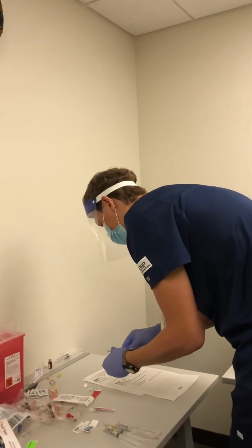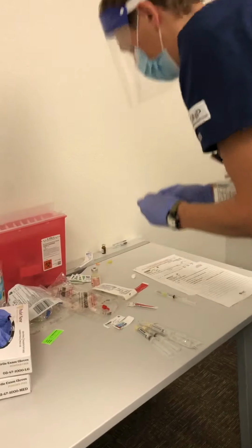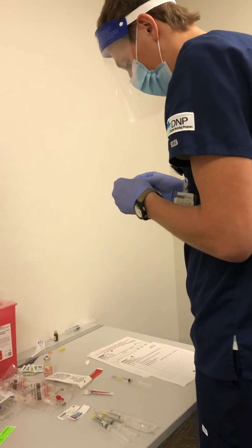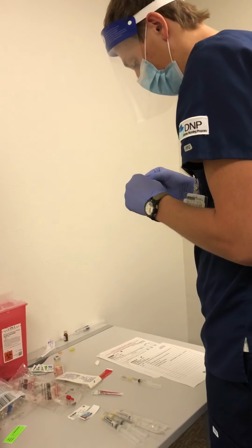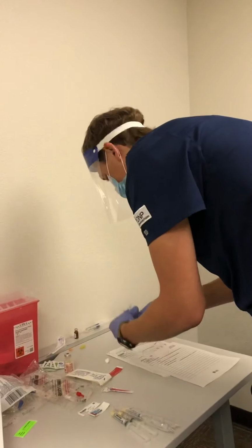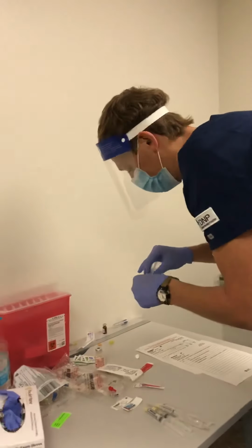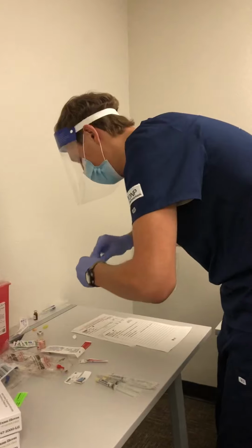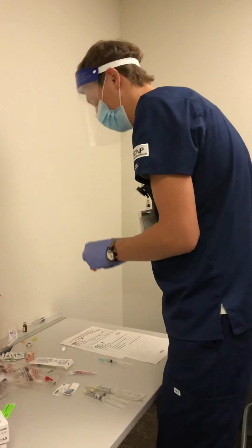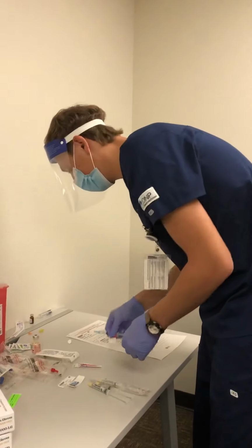And I can then dispose of this needle and get this cap ready. So the needle will go into the sharps bin, and then this will just be a protective cap so that it stays sterile while I take it to the patient's room from the med room. Go ahead and attach my med label that I filled out earlier. And that medication is ready to go.